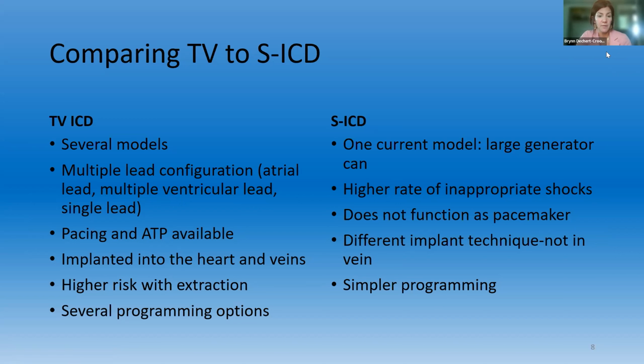As I mentioned before, these devices are implanted into the heart, into the veins. And if something happens to those leads, they break, they're old, we need to replace them, we do have to extract them and take them out. And that comes with its own risk. So extraction can be challenging. In our institution, we don't do them in pediatrics very often. So we utilize our adult colleagues to help us extract if that were to be necessary. Because like I said, there can be some more risk with that itself.